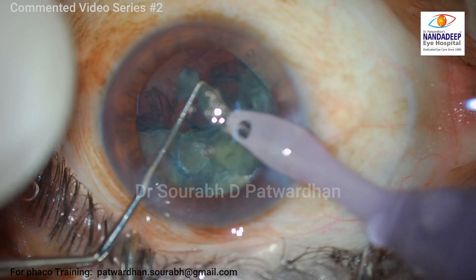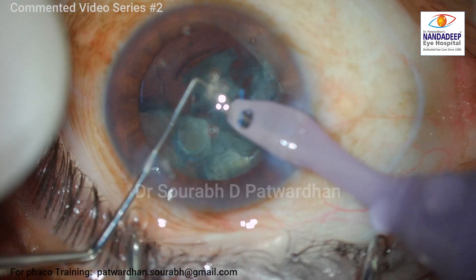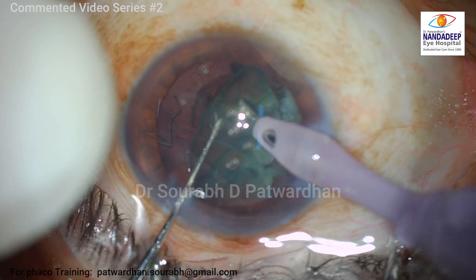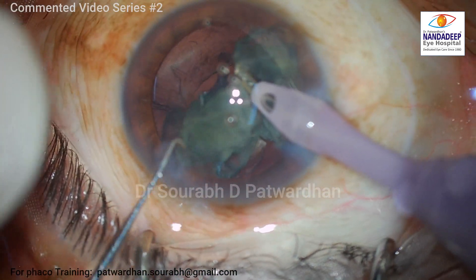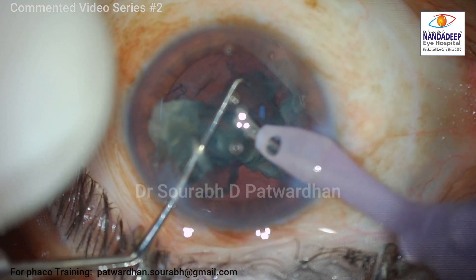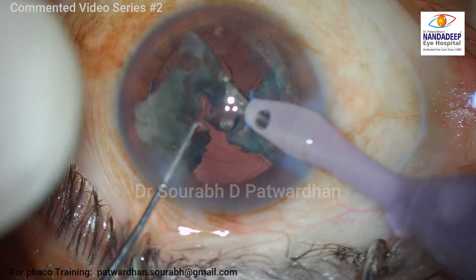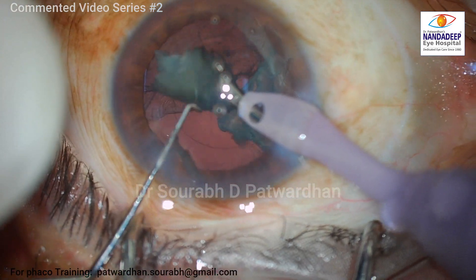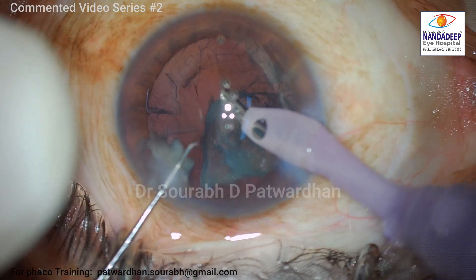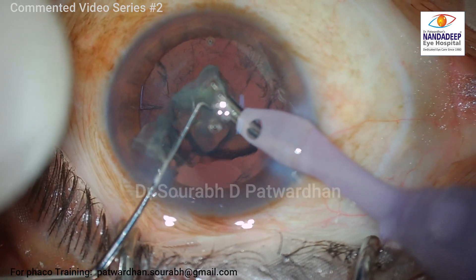I can feel that the posterior capsule is quite anterior because the lens thickness itself is very small — it's a feeling like the posterior capsule is right there below the FACO tip. So I have reduced my fluidics a little bit. I am trying to keep my FACO tip right at the center and avoiding any vigorous maneuvers. I am instructing my right hand to keep the FACO probe as steady as possible, and the tip position I am not going to alter at all, because the posterior capsule is very close.